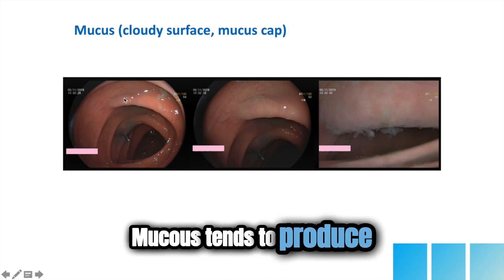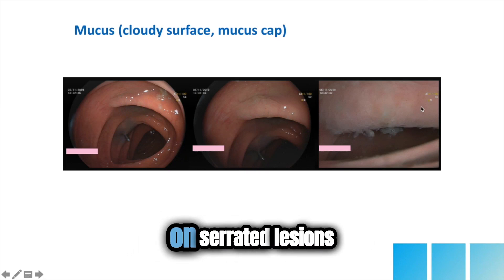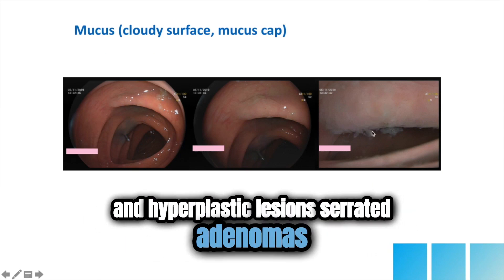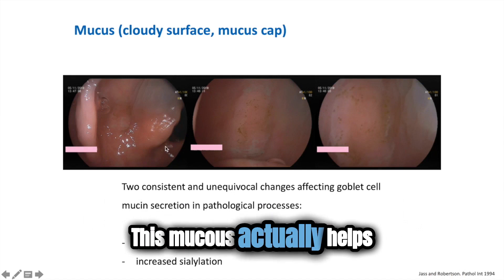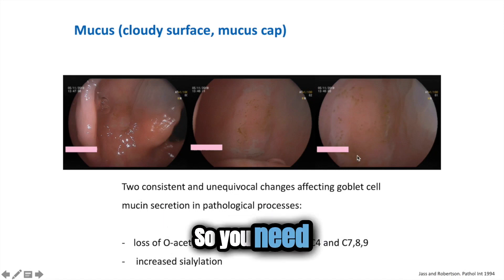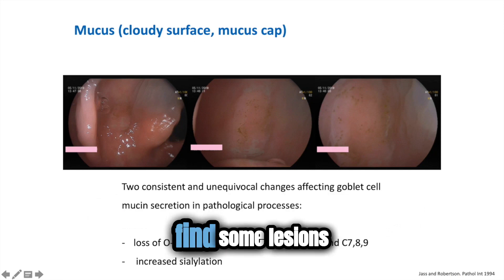Mucus tends to produce a little cloudy surface, as you can see, on serrated lesions, on serrated and hyperplastic lesions, serrated adenomas. This mucus actually helps you find the lesion. Sometimes it's stained with a little stool. So you need to be looking at this natural chromoendoscopy to find some lesions.